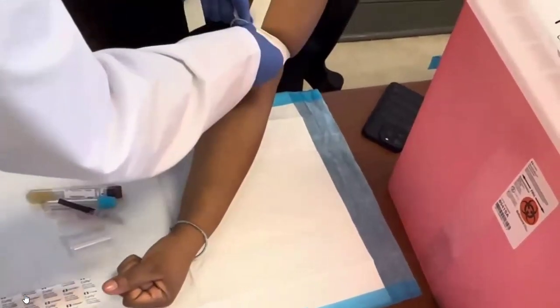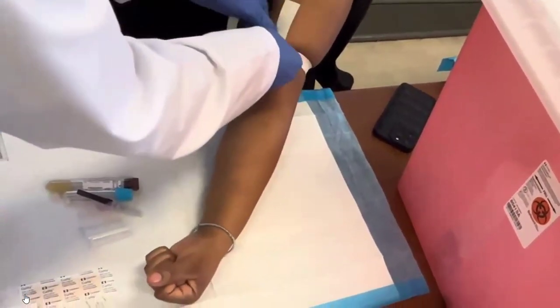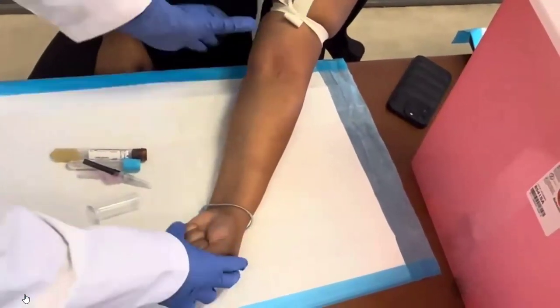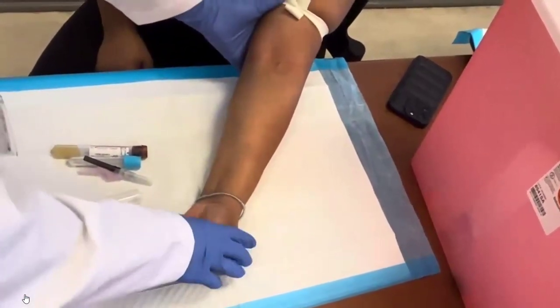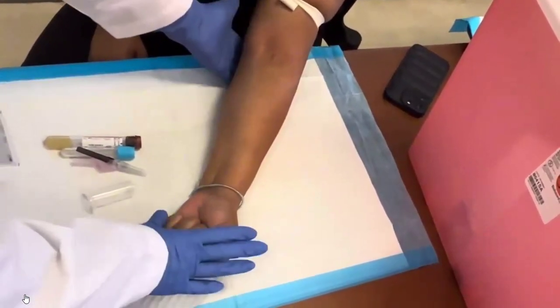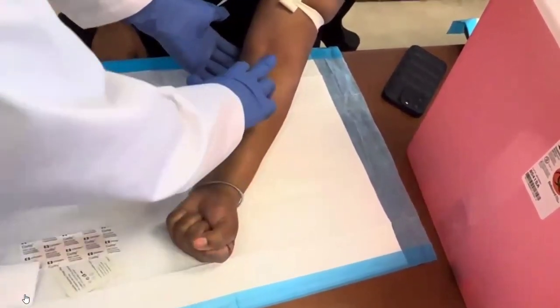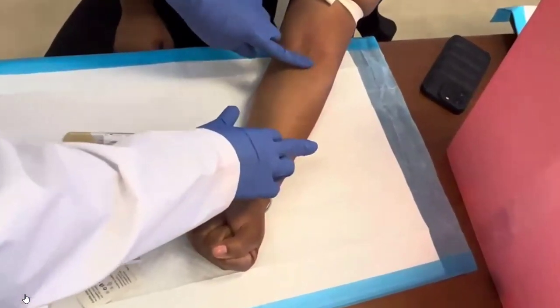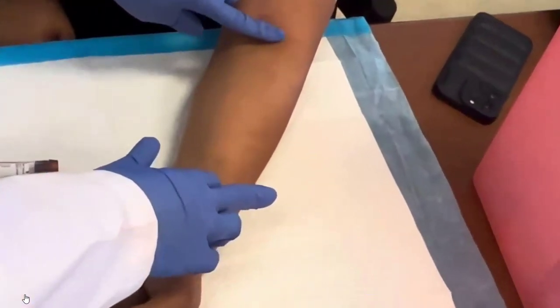So I've already verified her name and date of birth and made sure it was okay for me to do this, right? So I have the tourniquet on. I'm just going to have her make a fist. Now, I'm not going to have her pump, because if you pump, that can alter the results. So we're going to actually just have her make a fist there. And as you can see, once she made that fist, her vein became even more prominent, okay?